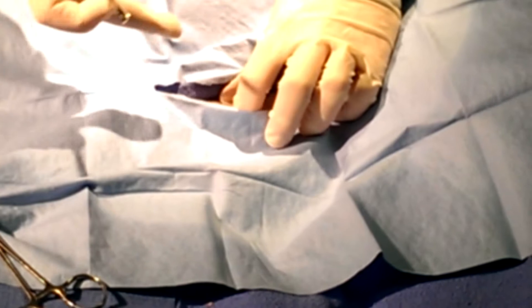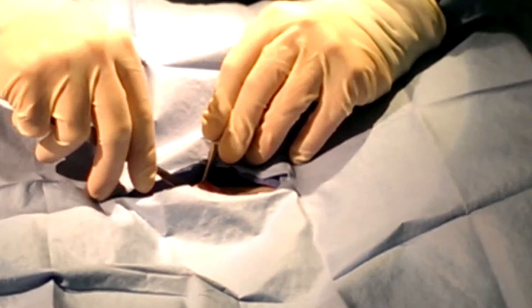Of course, we're using the linea. We're just going to go through the skin. I'm going to go a little wider on the incision just so I can show you all around a little bit. Let me get rat-tooth forceps — the one-way tooth.